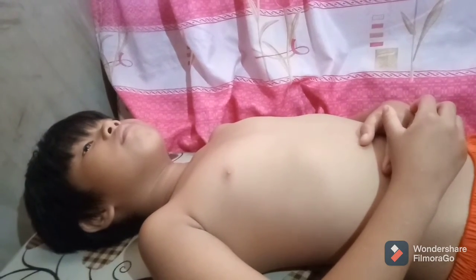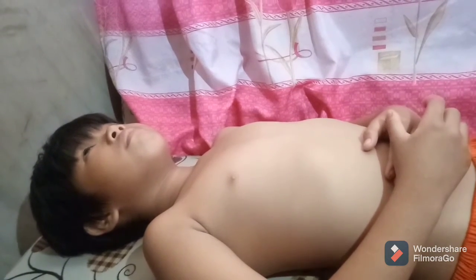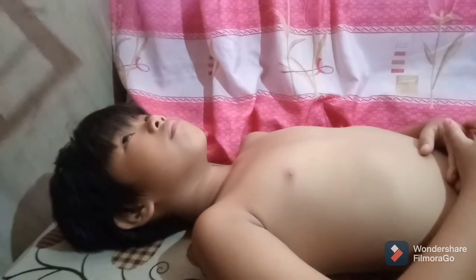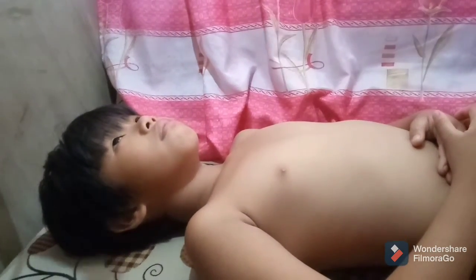So in AP projection of the skull, center the central ray at the glabella of the patient.